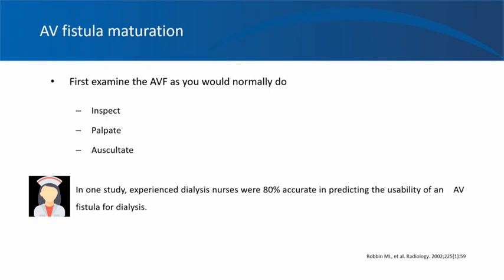And next, palpation. So gently feel for a pulse. Be careful in doing so, because if you compress the vein too hard, you'll create a spurious pulse. The pulse of the fistula should be soft and compressible. A strong thrusting pulse, that is hyperpulsatility, indicates the presence of a downstream problem, that is in the direction of flow, creating increased resistance. If there is no thrill or pulse, the AV fistula may be thrombosed.